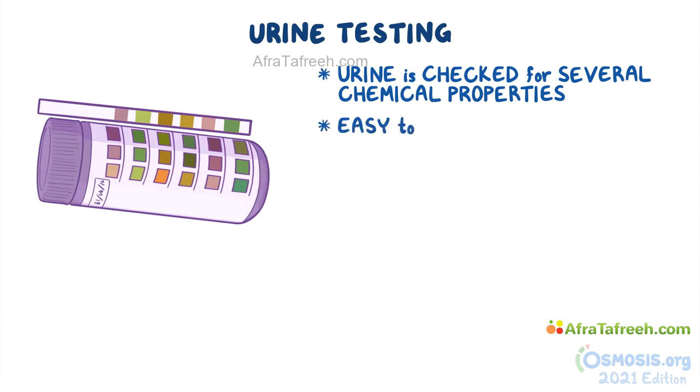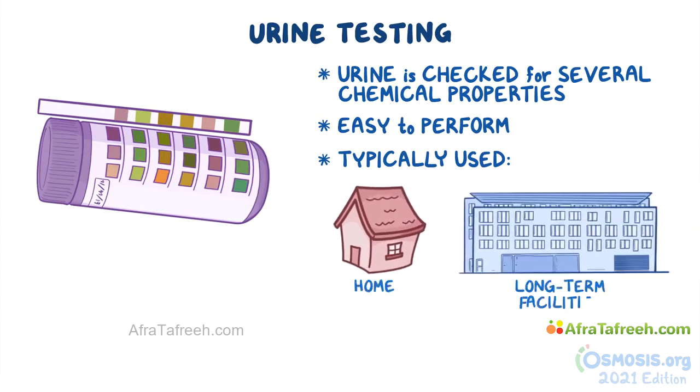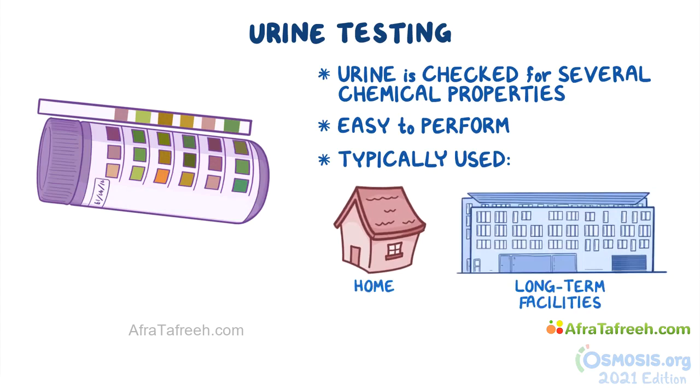Urine testing is easy to perform, and it is typically used for clients receiving medical care in their home or in long-term facilities where more detailed laboratory testing is not available.